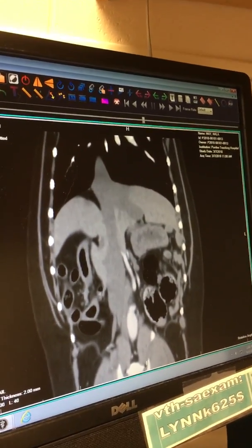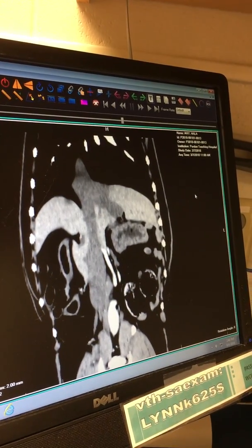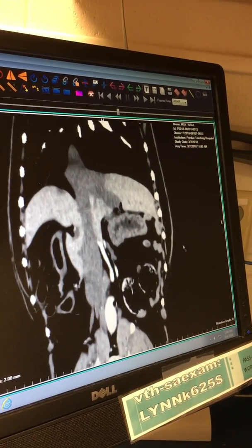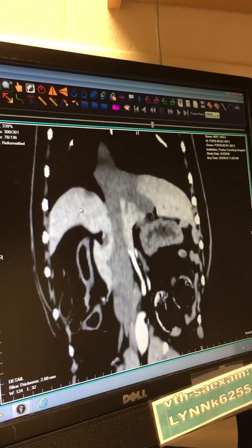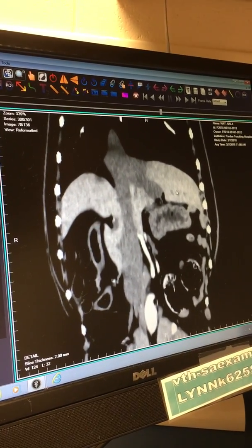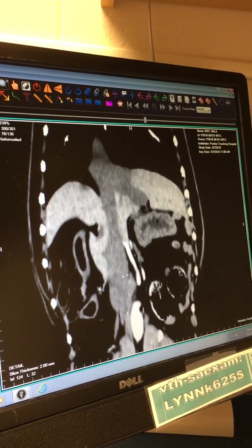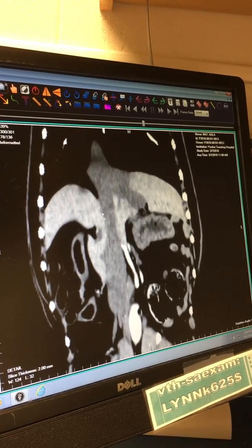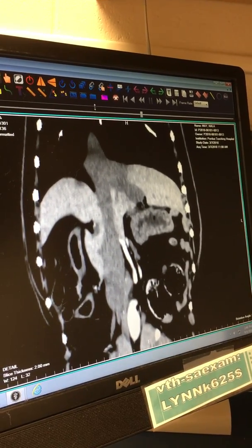Okay. So I'm going to contrast just a little bit to highlight the difference here. So here's the liver. The parenchyma, or the tissue of the liver, is right here. This is the caudal vena cava, the big vein in the abdomen that drains the blood from all of the organs. And then here it is, coming up on top of the liver and going forward towards the heart.